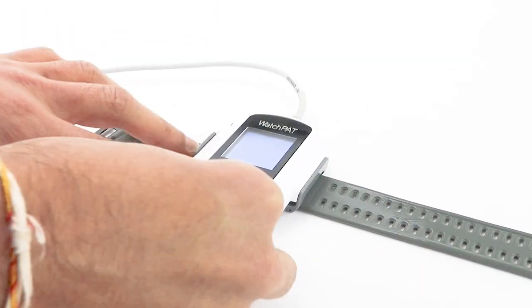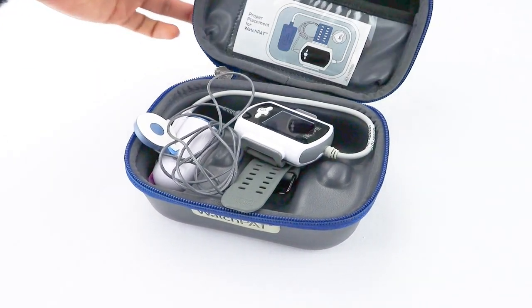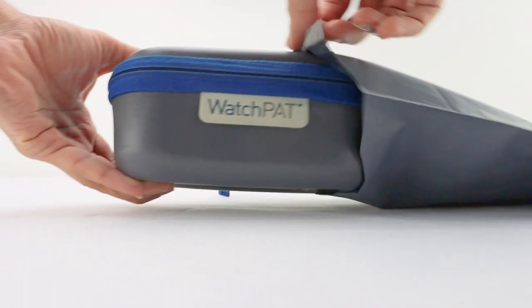When you wake up the following morning remove the device and sensors. The test will turn off automatically. Please use the included sterilizing swab to wipe down the equipment and place the sensors and device back into the protective case. You can now place it into a prepaid envelope to send back to us.